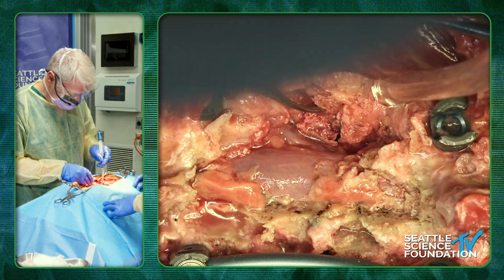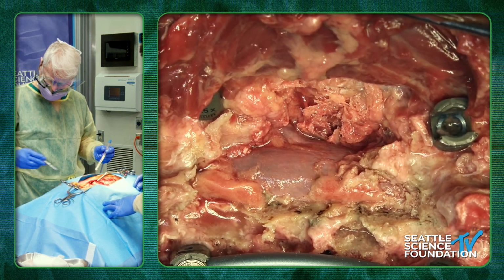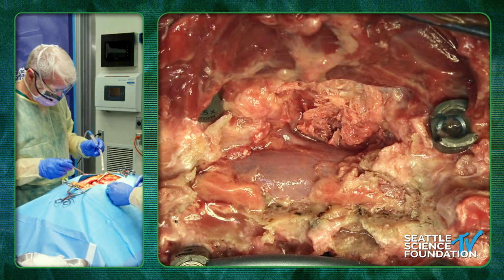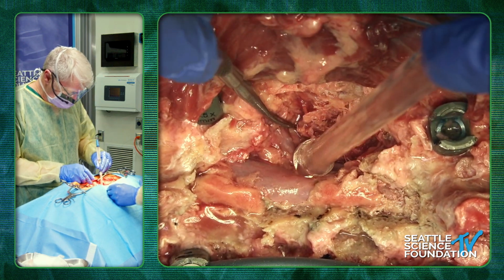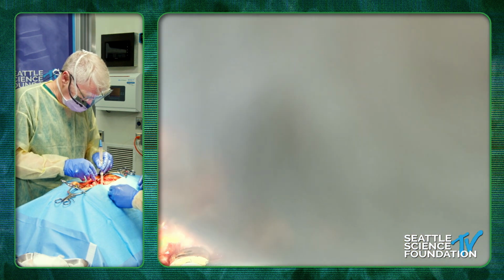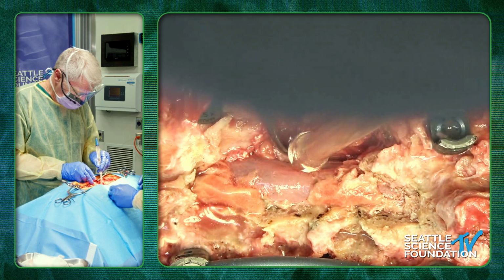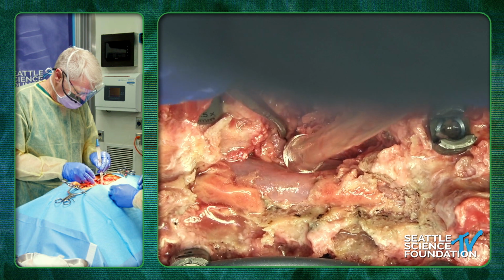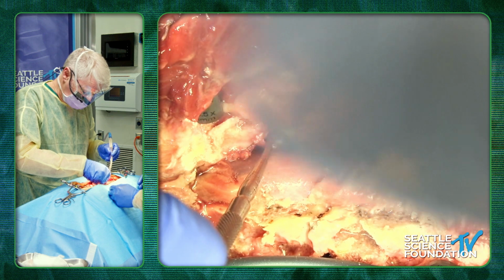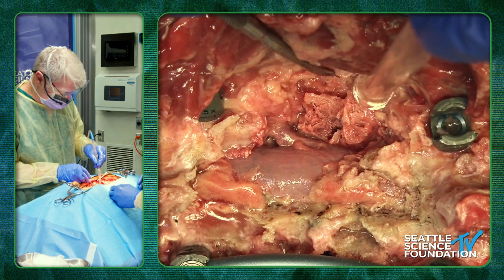So what we have now is an isolated pedicle with the nerve root with no other bony attachments except for the body now. So our next move is going to be to move the nerve out of the way. Now, if you want a big osteotomy, what I like to do is at least subtract the pedicle. But if you need more, then you have to come into this zone here in the foramen and work underneath the nerve root. But I usually do this cut first here. So I want to see how much I can bring the nerve down, and usually that would be enough. And if I want more, then I'll work over here and make a second cut over here. So that would be, I'm set up for the PSO on this side.